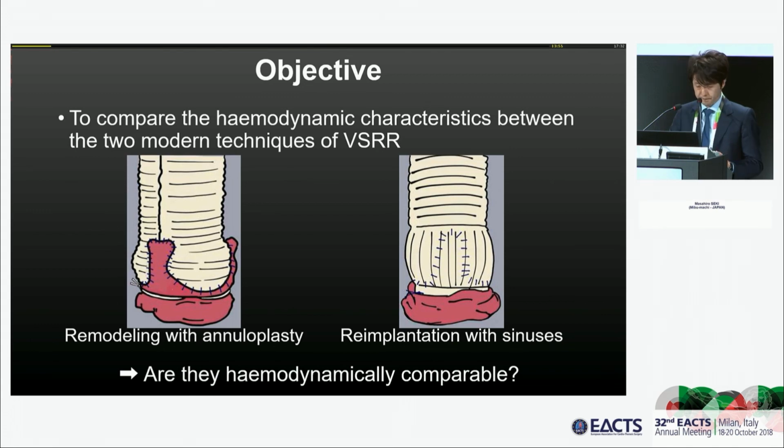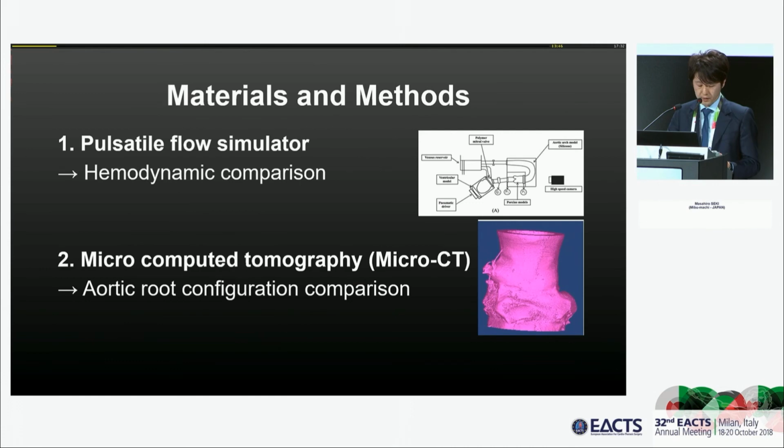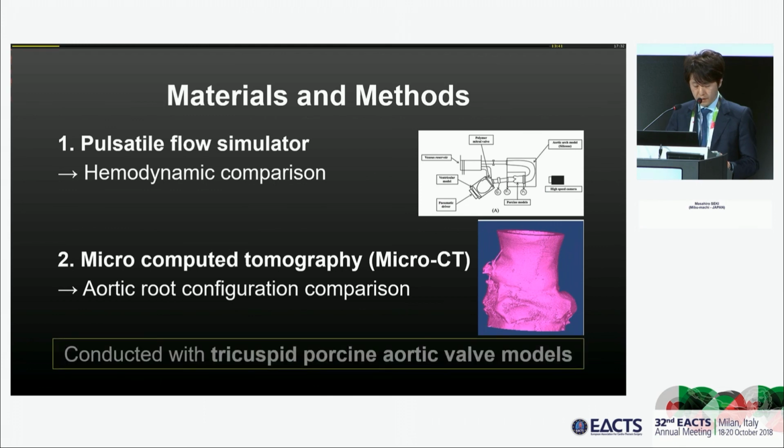2 studies were conducted. First, a pulsatile flow simulator study was conducted to compare the hemodynamics. Second, a microcomputed tomography study was conducted to compare the root configuration. Both studies were conducted using tricuspid porcine aortic valve models.